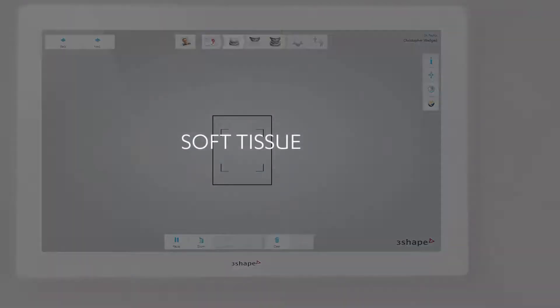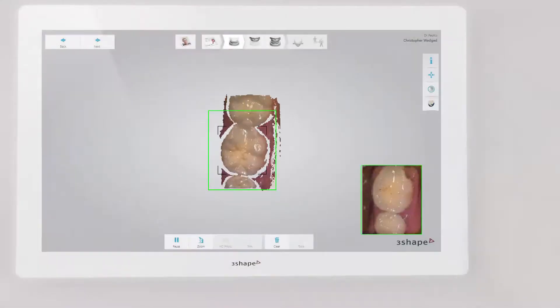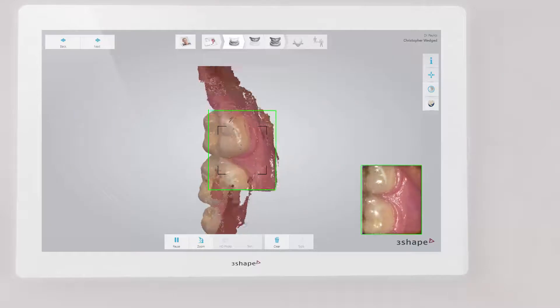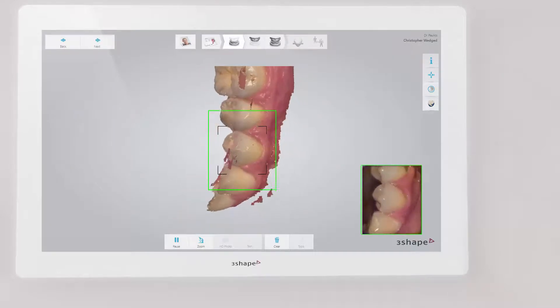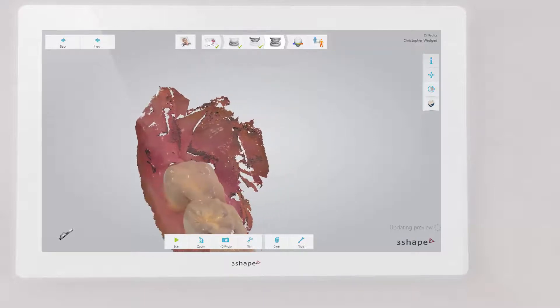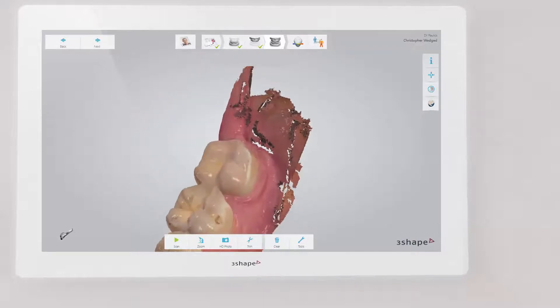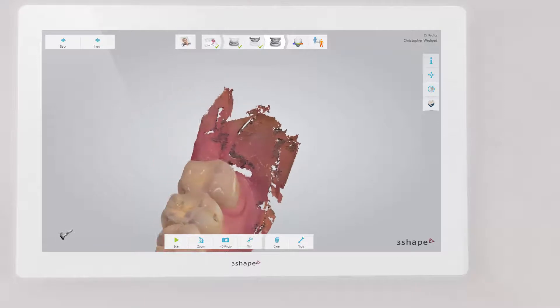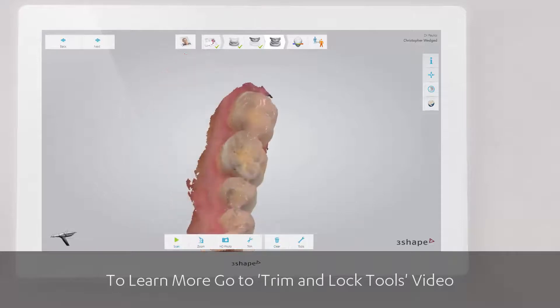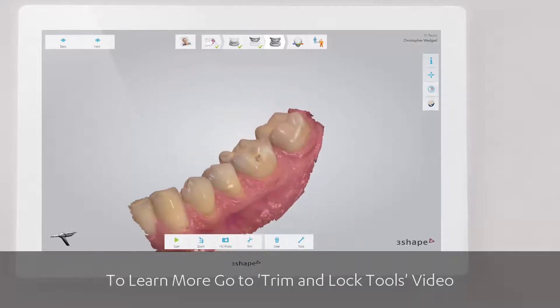Avoid excess soft tissue at the back. This may be to the distal of the last molars or large portions of sulcus to the cheek. If you scan larger areas of soft tissue — for example, sulcus, distal of the last tooth, the mouth bottom, or cheek — remember to use the trim tool to clean up the scan. Clicking the 'All Patches' button will remove the outlying areas.